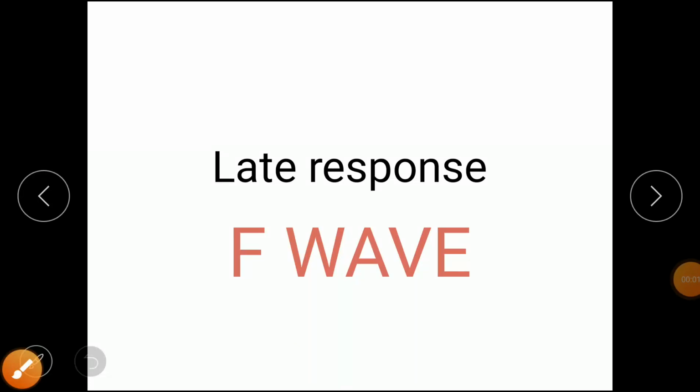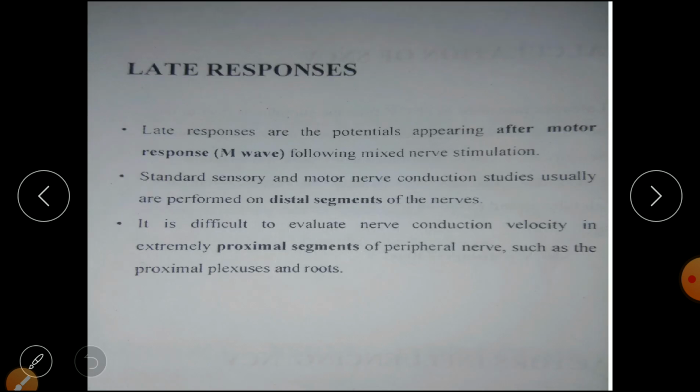Hello everyone. In this video we are going to discuss late responses. Late responses have two types, F wave and H reflex. In this video I'm going to talk about the F wave.